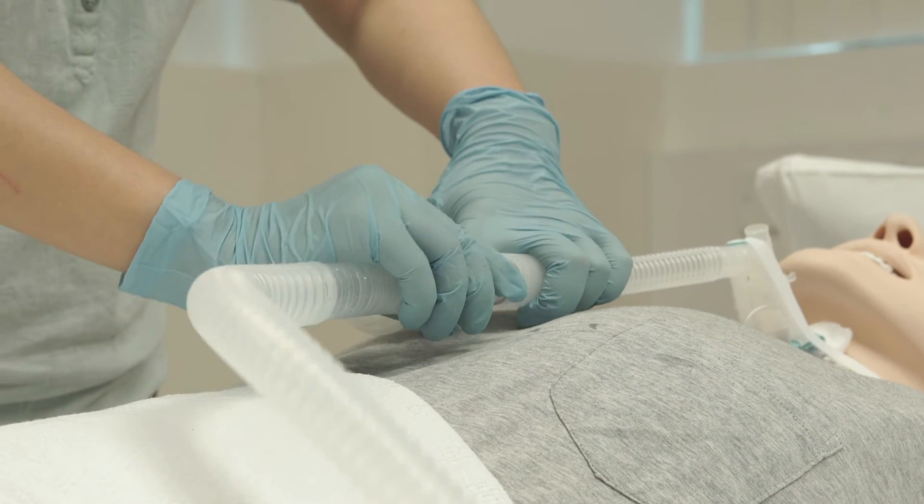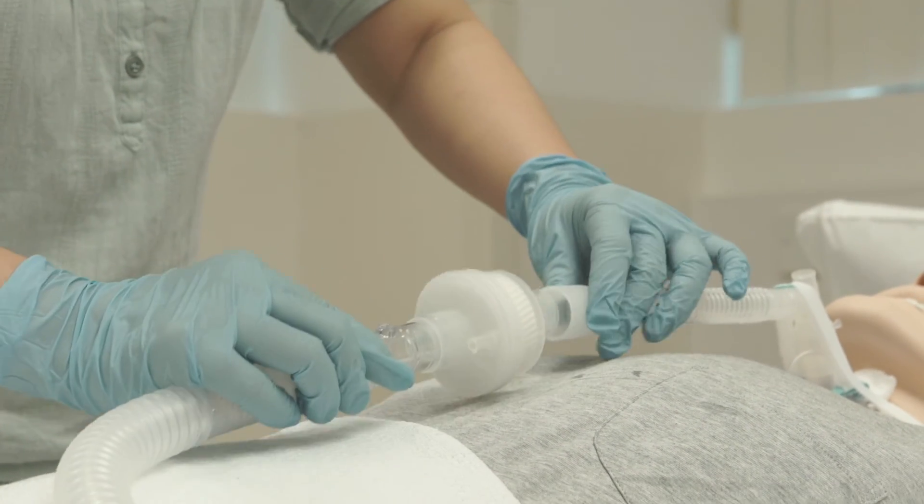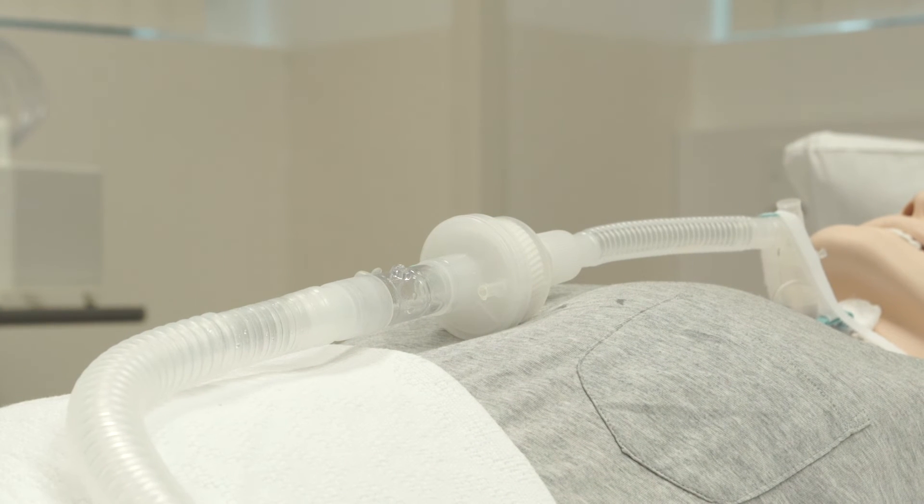Insert the HME in the circuit between the exhalation port and the trach adapter. Change the HME when it is stained with secretion or becomes wet. Otherwise, change it every two days.